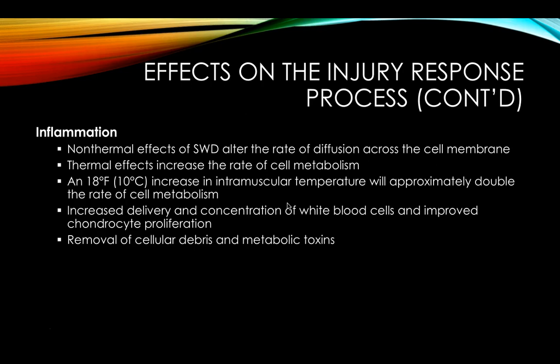We're going to get a lot of removal of cellular debris and metabolic toxins, all because of, again, those non-thermal effects, as well as, if we're in the later stages into the proliferation, that increased cell metabolism.